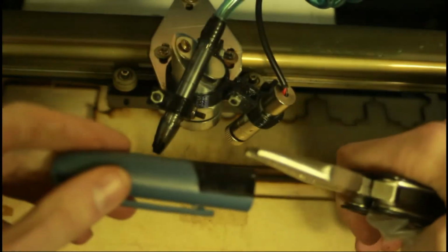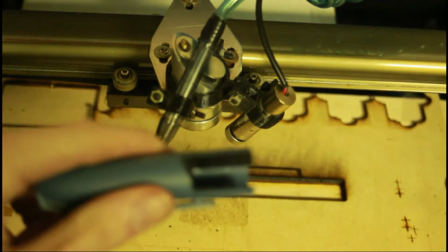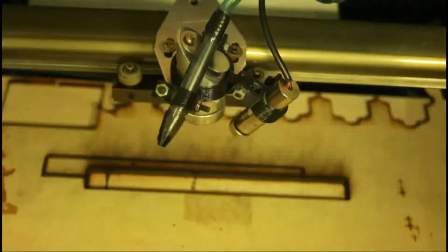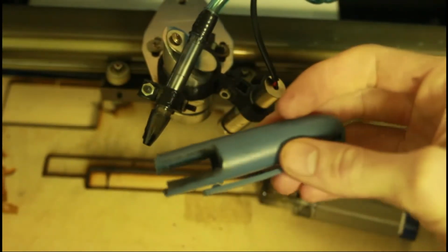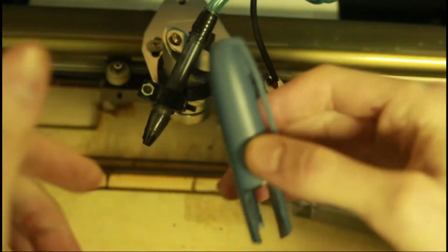Just take some pliers and pry this off like so. We're going to scrape a little bit with the scraper, and then we're going to do the other side. There we have it. Now the notches are complete. Last thing we got to do is cut a hole here so that way the syringe can fit through.